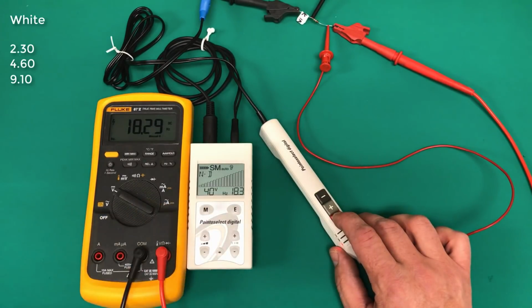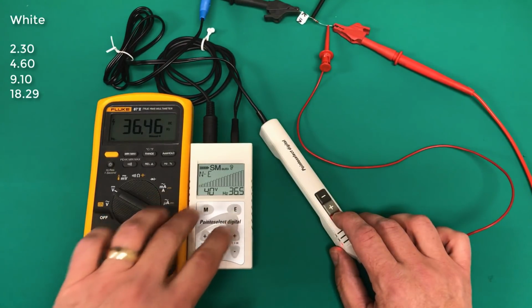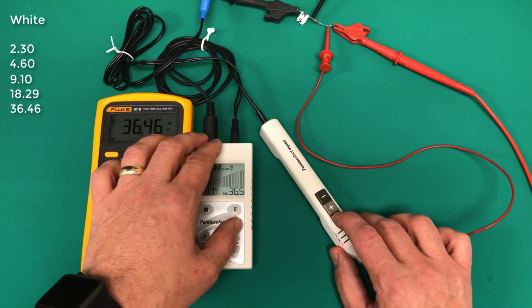I'm loving it. All right, 18.3 gives us 18.29, off by 1/100th of a hertz. That is beautifully accurate. That's less than 1% variance. We go to 36.5 and we get 36.46, 4/100ths of a hertz difference. Still very, very tight tolerances. Obviously a well-made unit.